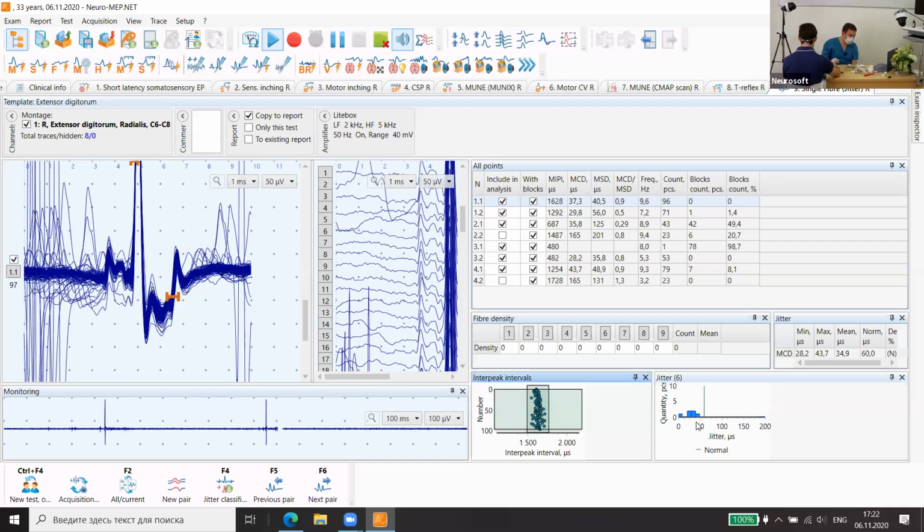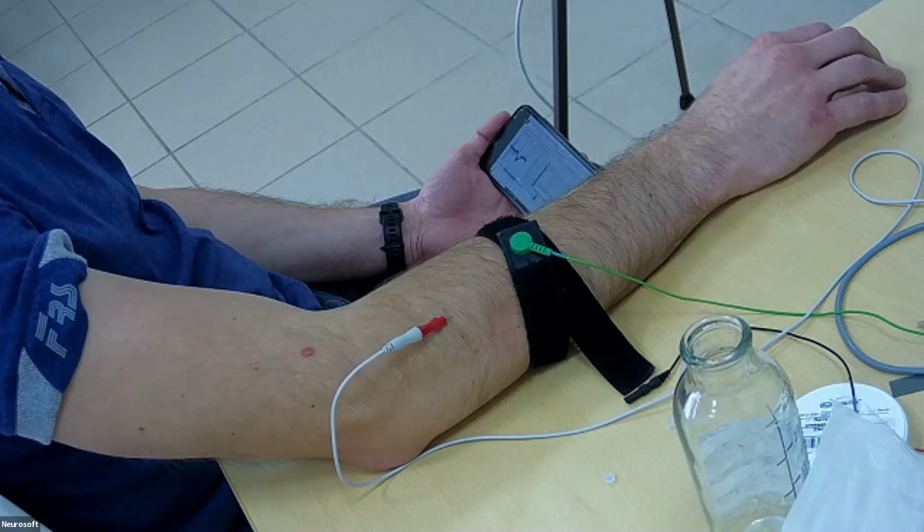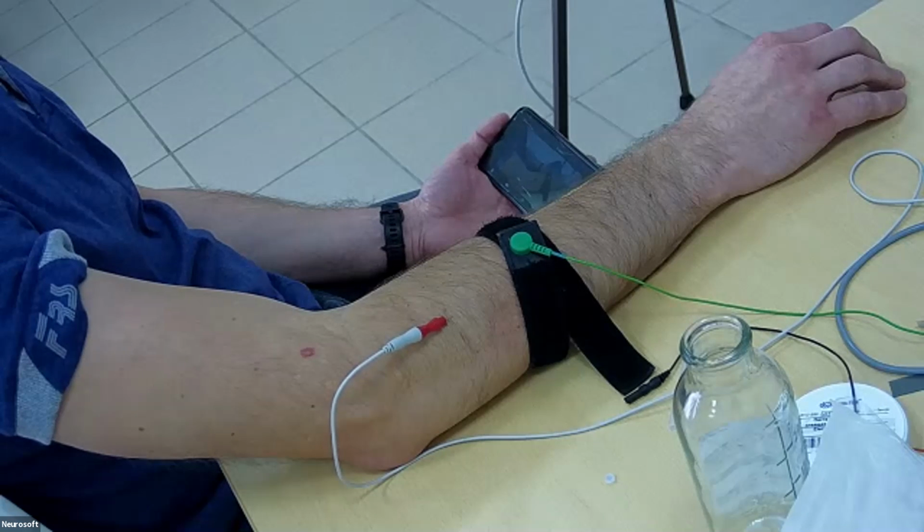Something like this. We will not demonstrate stimulation jitter today, but it's developed mostly for facial muscles, for orbicularis oculi and frontalis, with needle or adhesive electrode stimulation. And the last, we will perform macro EMG electrodes. So we will use the same needle.